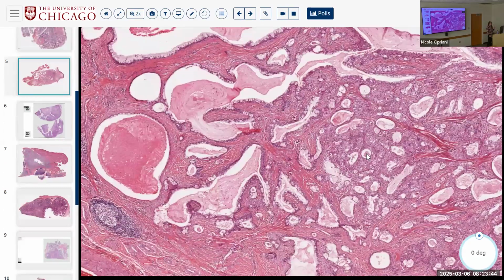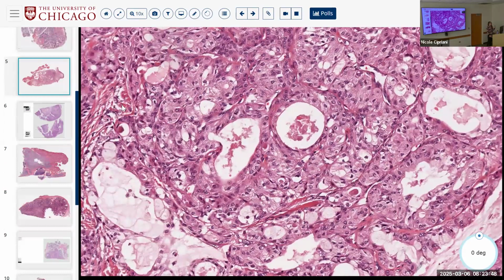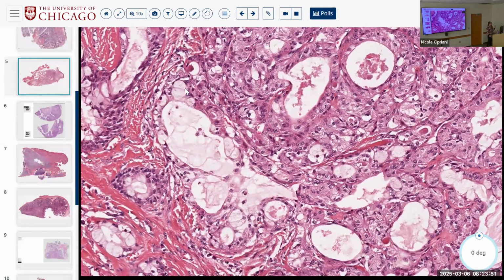And the other difference between mucoep and Warthin or oncocytic lesions is that aside from the mucin-rich cells, essentially all of the cells of the mucoepidermoid carcinoma, the intermediate cells, the squamoid cells, all express, what's the marker we just talked about? Yeah, P63, P40, right?